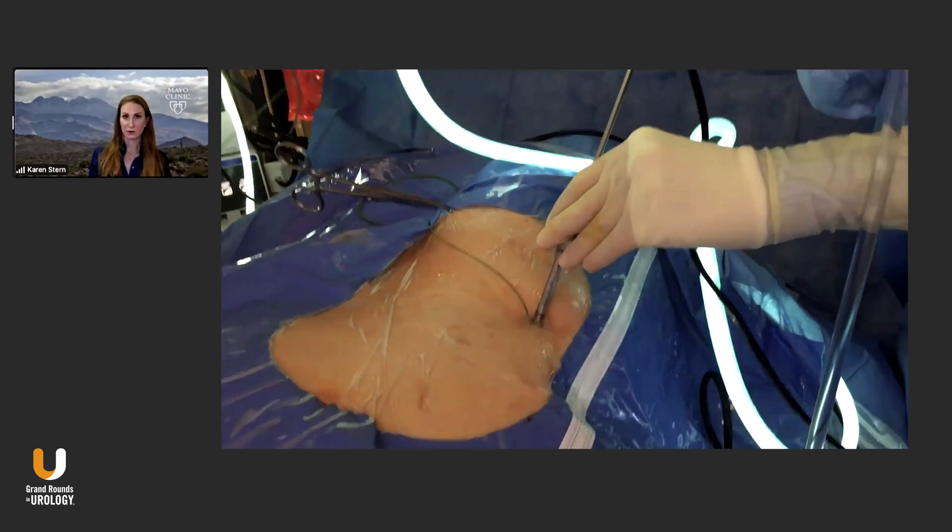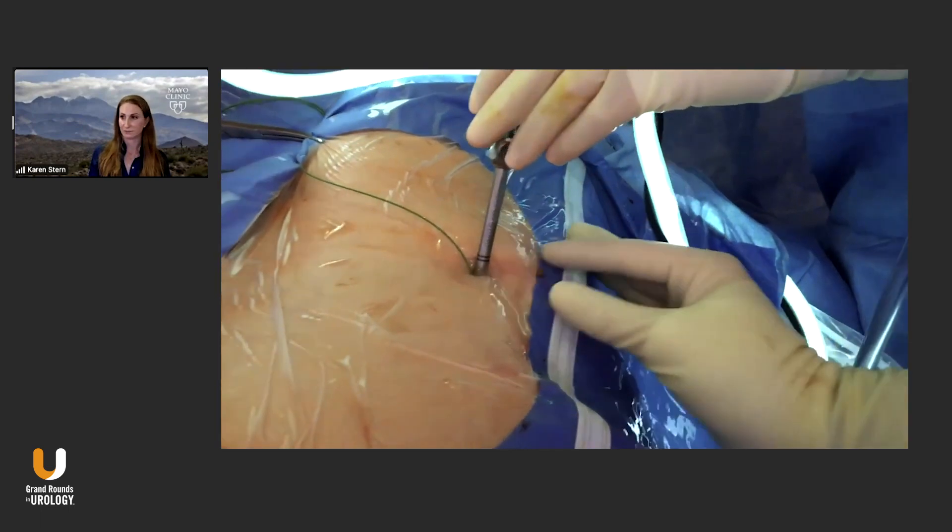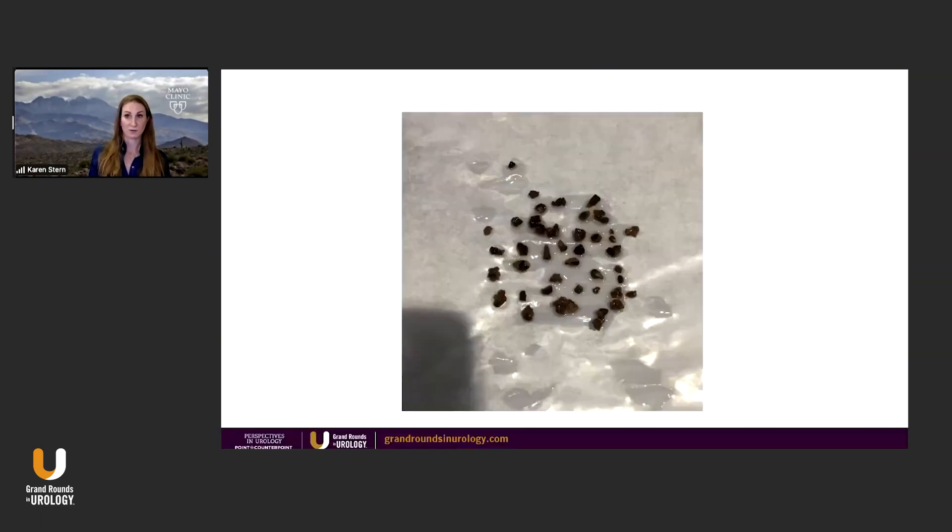Looking at it from another view, here's from outside the body. Again, you're just withdrawing your scope and the fragments are coming out. Larger fragments — yes, it's not that one-centimeter stone you can just grab out with your standard perk, but there are other advantages to why this is better.